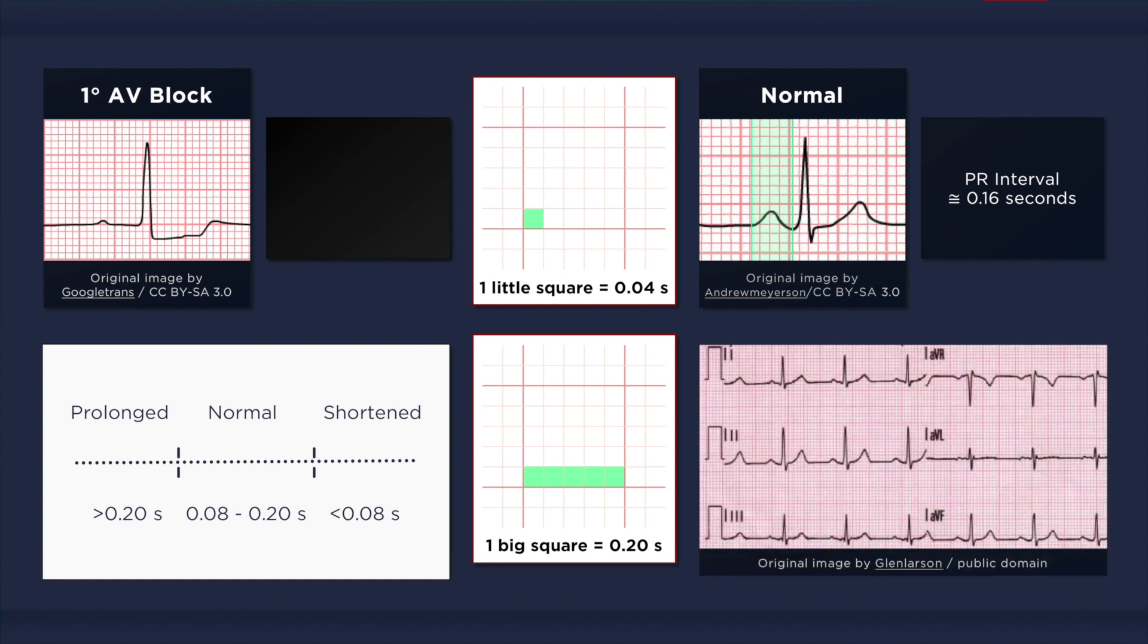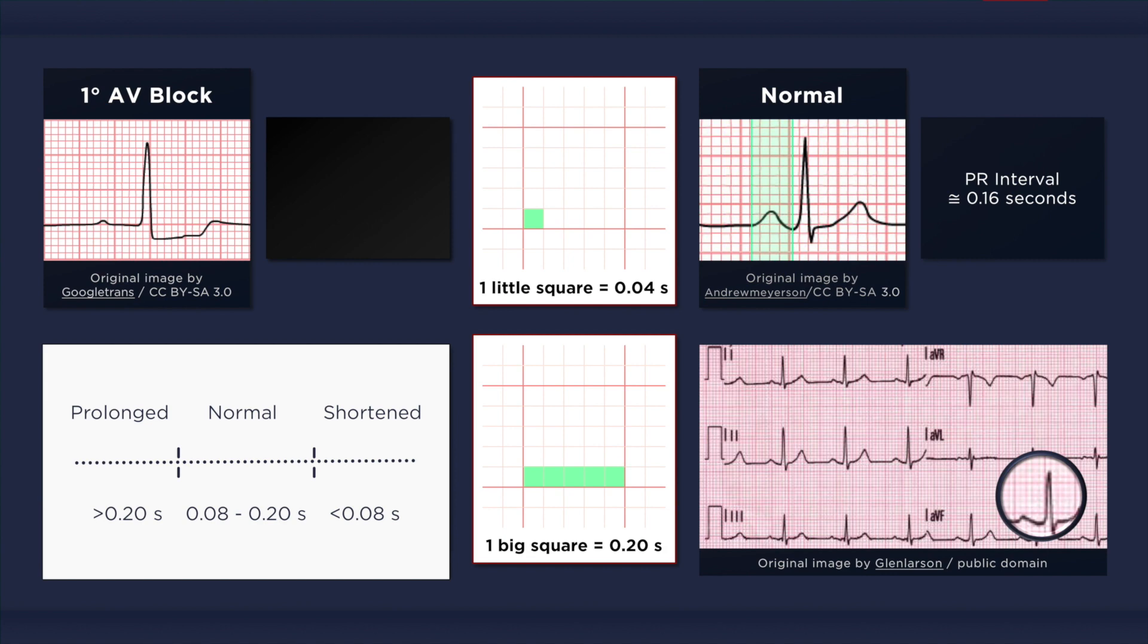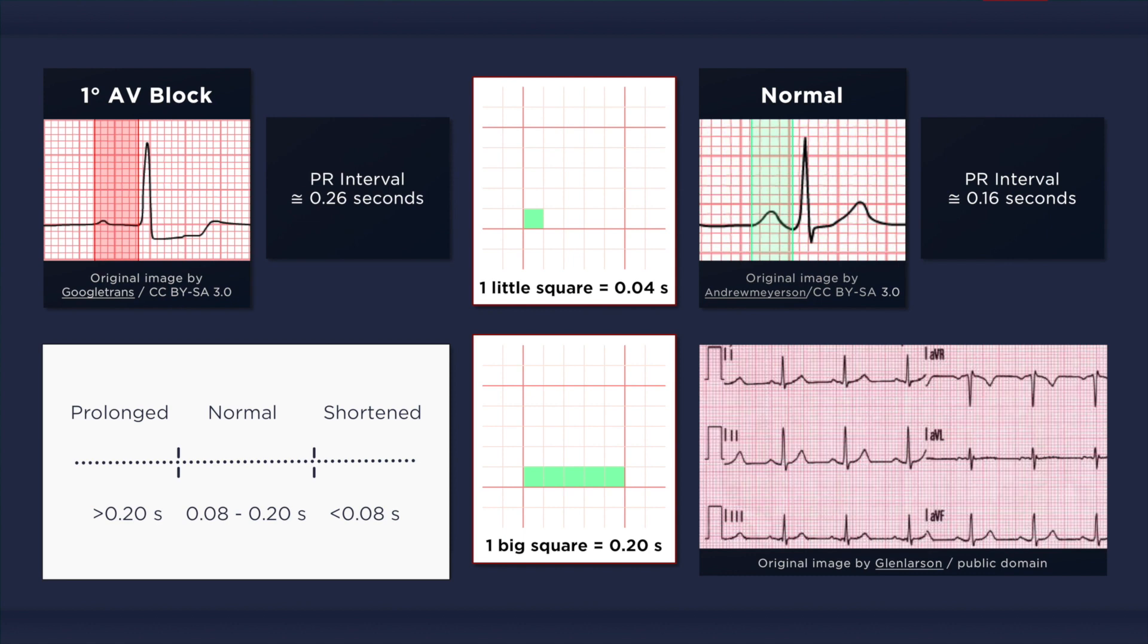Now let's look at the image below. The entire PR interval fits within one big square, so even without calculating it, we already know that it's less than 0.2 seconds, and thus it's not prolonged. Now let's go back to the ECG with first degree AV block on the top left corner of the screen. We can see that approximately 6.5 little squares fit within the PR interval. This equates to 0.26 seconds, which is prolonged.